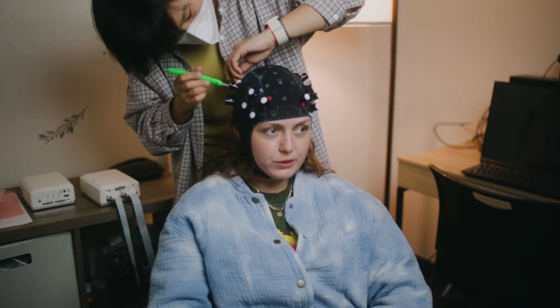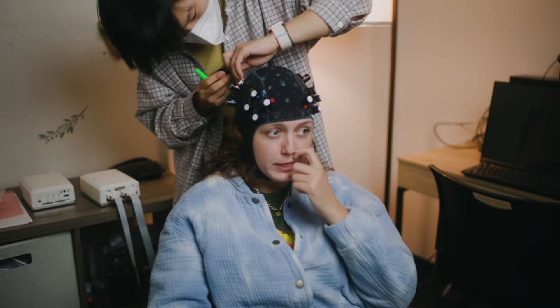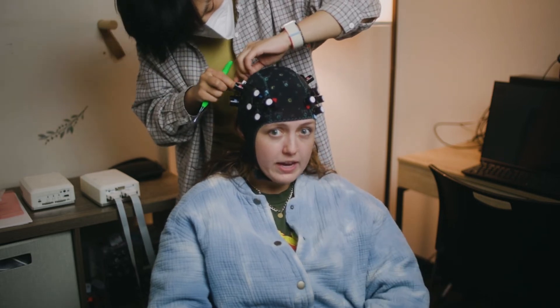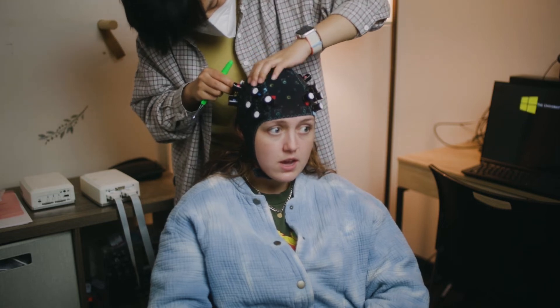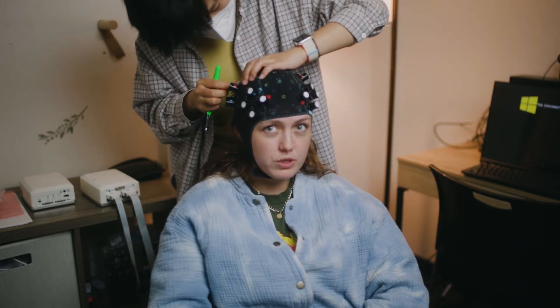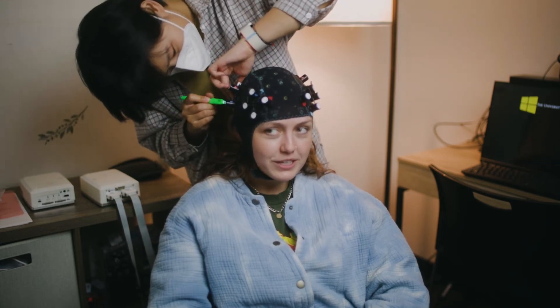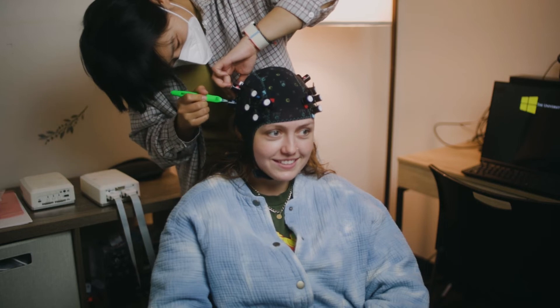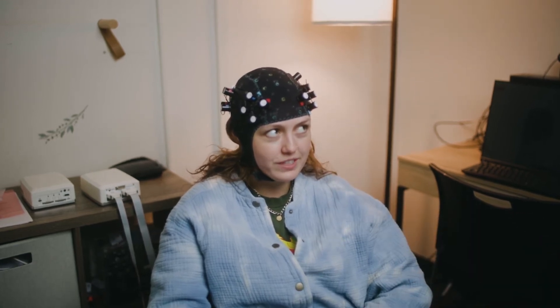What we usually do is if it takes more than 15 minutes to fix — so if she checks the signal and it's still bad, she'll probably try one more time — but if it takes more than 15 minutes we usually just continue with data collection because we don't want to keep the participant here too long, especially when we're dealing with children, as their patience is thin. We can't check the signal in real time, so we're going to have to rerun signal optimization to see if those channels have been fixed.